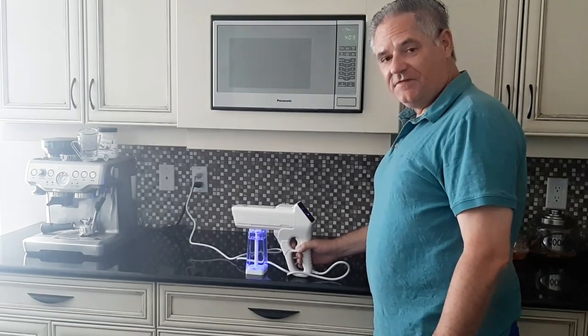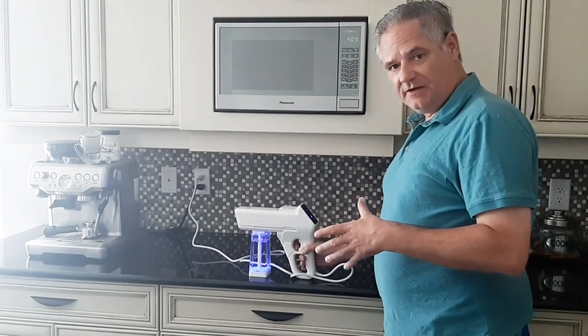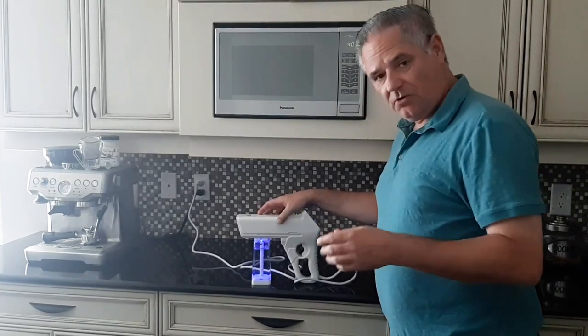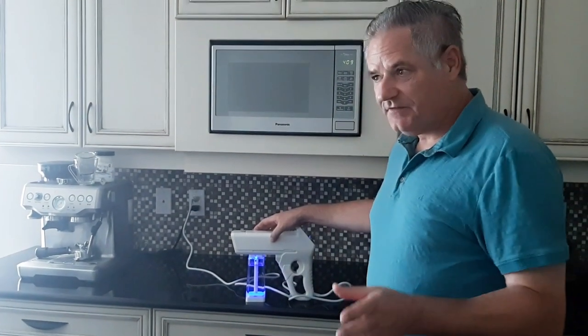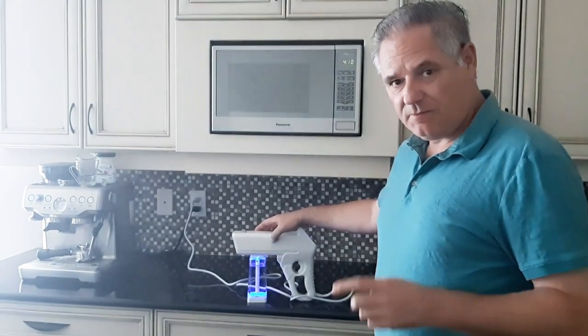Hi, this is James Smith from Disinfectant Fog. I want to show you the latest fogger that we've gotten in for testing. Imagine this device being used in your home, your dental practice, or any office, even inside mobile solutions like cars. It's going to be perfect for it.